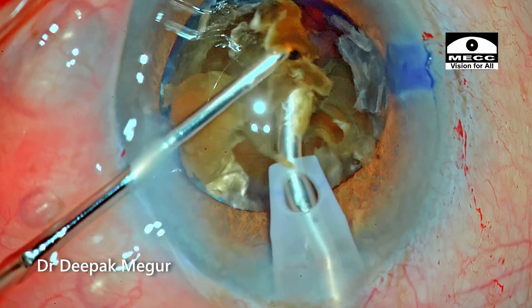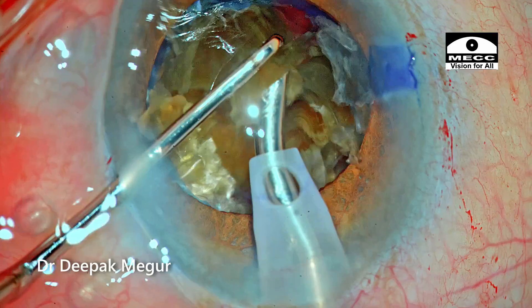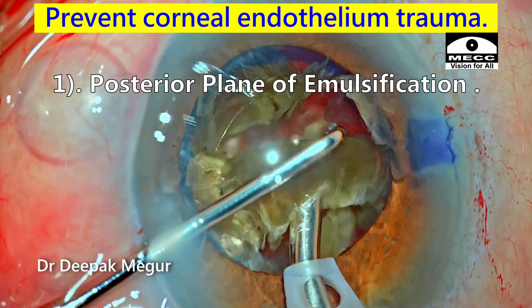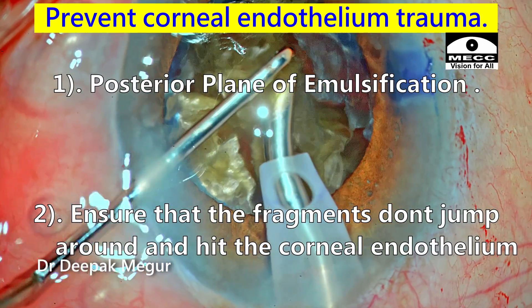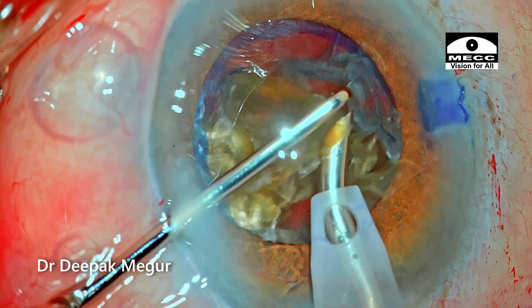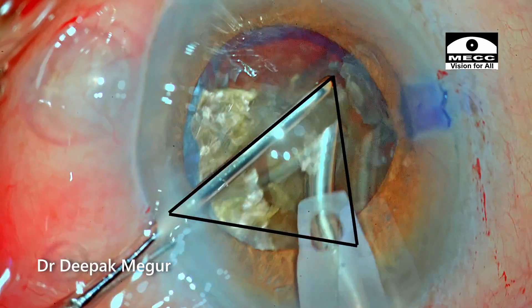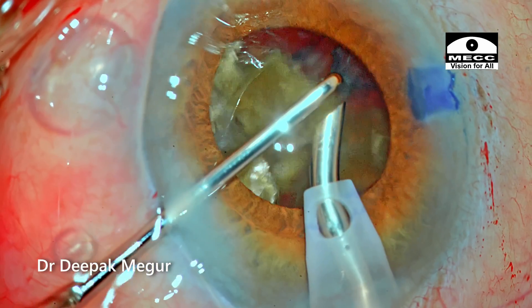During emulsification of the fragments, two things are critical to prevent endothelial cell trauma: number one is a posterior plane of emulsification, and number two is ensuring fragments don't jump around and hit the corneal endothelium. To achieve this, I ensure my chopper is slightly above the phaco tip, acting like a shield preventing fragments from escaping the area and bombarding against the endothelium.